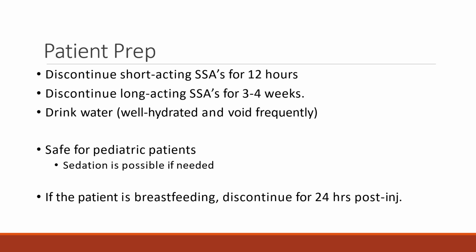Patient prep is to discontinue the short-acting somatostatin analogs for 12 hours, long-acting for 3 to 4 weeks. There has been some discussion over these guidelines in the past because different drug companies may recommend something slightly different.